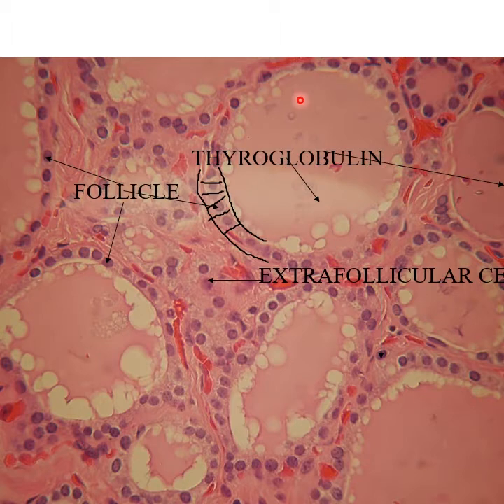And I mentioned in lecture, one of the reasons you have this large amount of extracellular storage, which you don't have in most of the other endocrine glands, is this is a way to really store the iodine. The tyrosine amino acid that's used to make T3, T4, or thyroxine, that's pretty easy to come by. Iodine can be a little bit patchy, so we've evolved a way to store a large amount of this precursor hormone with the iodine ions already attached. So if you're in an area where you can't eat the iodine, doesn't matter, you've got a storage form here, so your metabolism won't drop and a predator won't eat you. So this is the thyroid follicle.